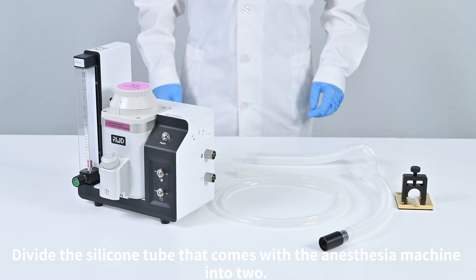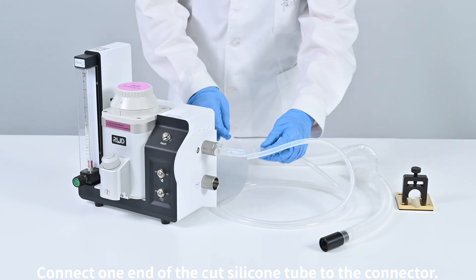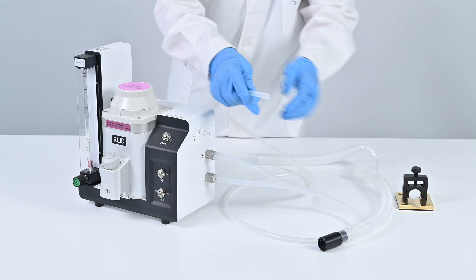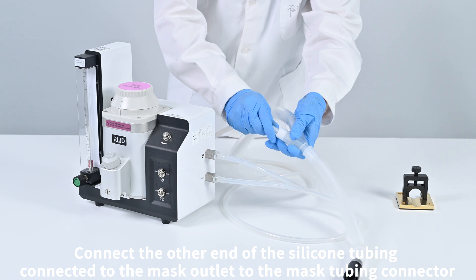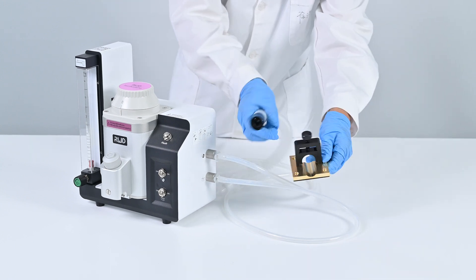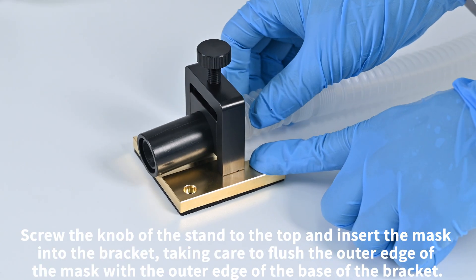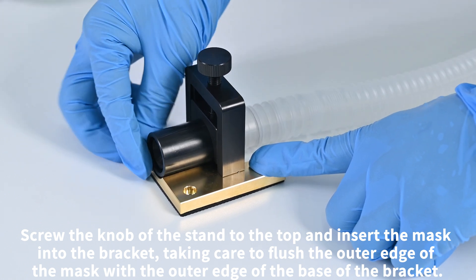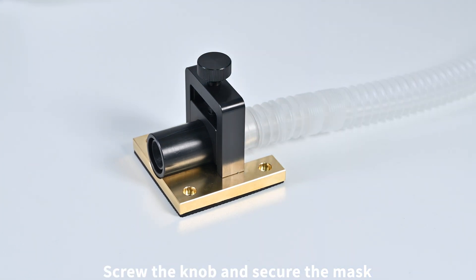Divide the silicone tube that comes with the anesthesia machine into two. Connect one end of the cut silicone tube to the connector, and connect the other end to the mask tubing connector. Connect the mask bracket: screw the knob of the stand at the top, insert the mask into the bracket taking care to flush the outer edge of the mask with the outer edge of the base of the bracket, then screw the knob to secure the mask.